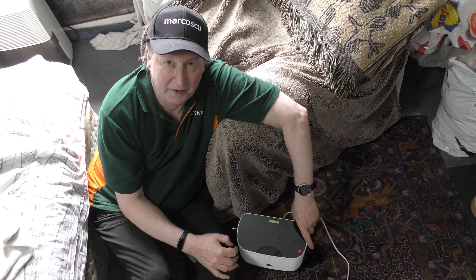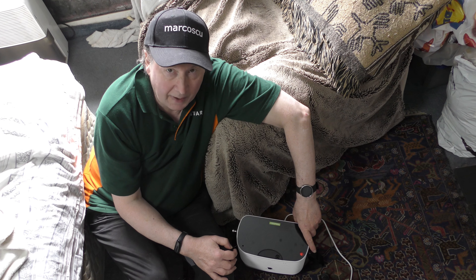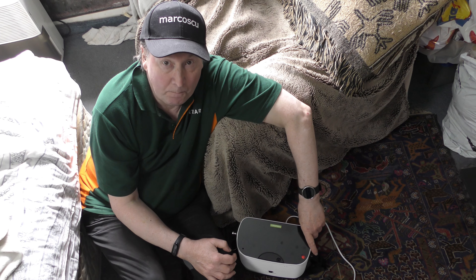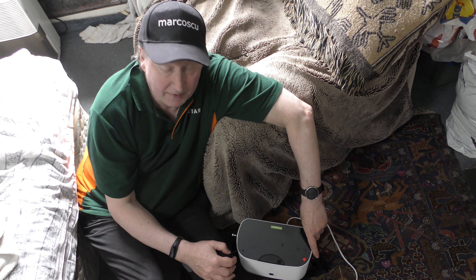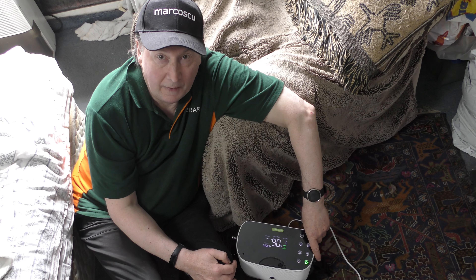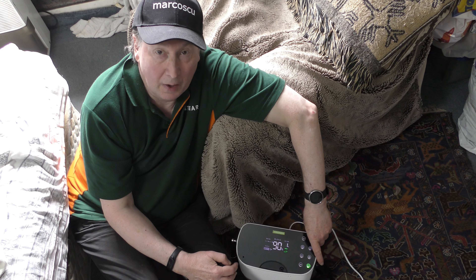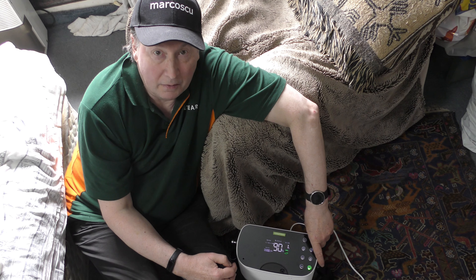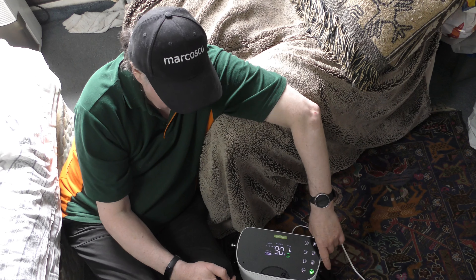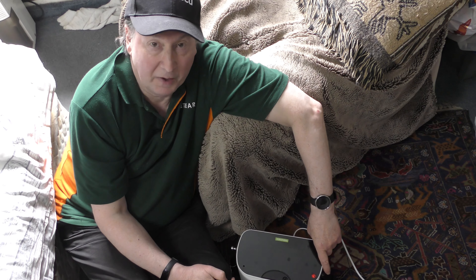Now let's do a test to see how loud this device is. I'm positioned about five feet away from the camera. The microphone is an on-camera shotgun mic pointing straight towards me. At the moment the device is turned off, so let's turn it on and see how loud it is. It's working away now and it's at full power, giving out 90% oxygen at one litre. So now you can see how loud it is. Let's turn it off. And the fan keeps going for a couple of minutes afterwards before it turns itself off completely.